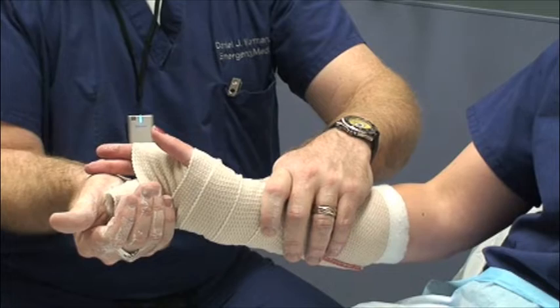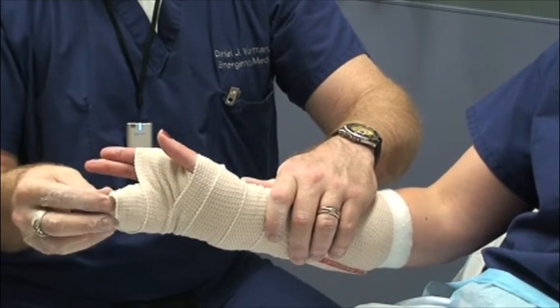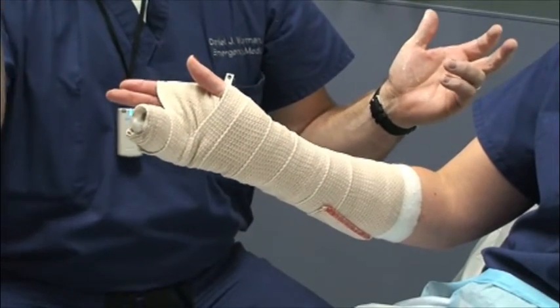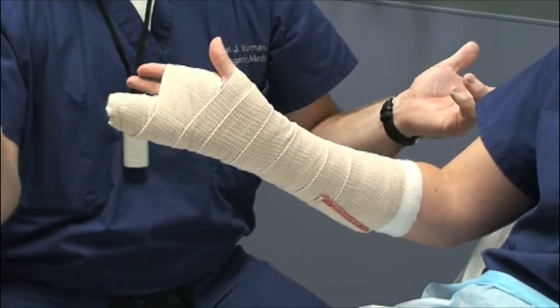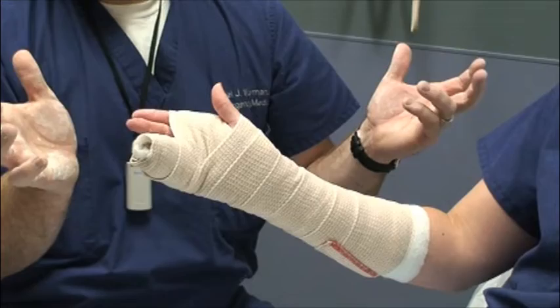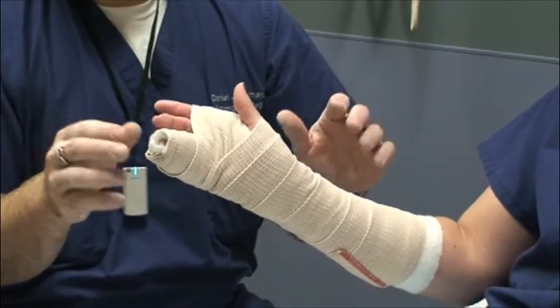Remember: the cooler the water used, the longer it takes to set. For something like this that you have to mold, you may have to stay in the room and hold it in position for a while, because the patient can very easily straighten things out at this point. Once things start to harden, the fracture is very fragile and it will crack if it's not held until completely hardened in place.